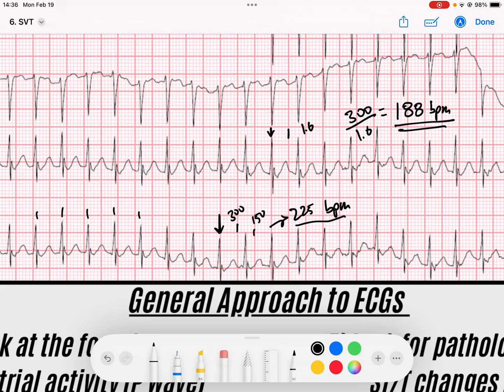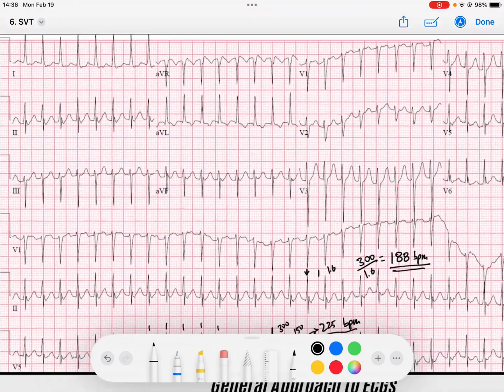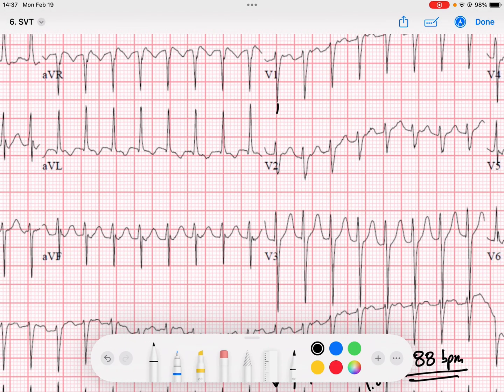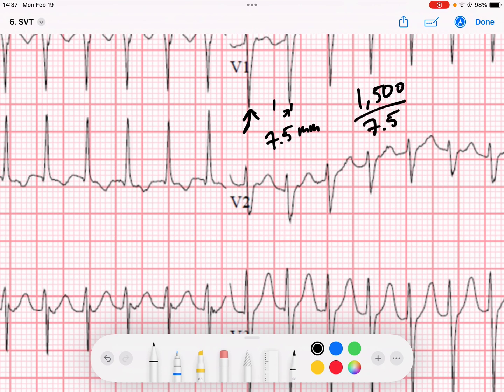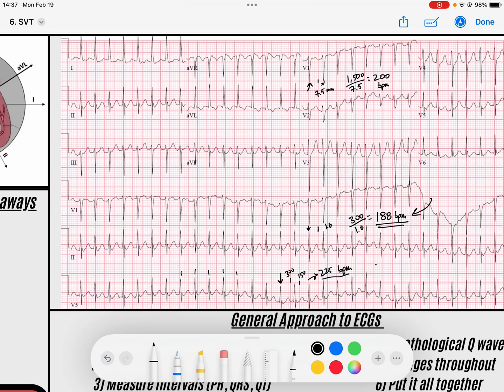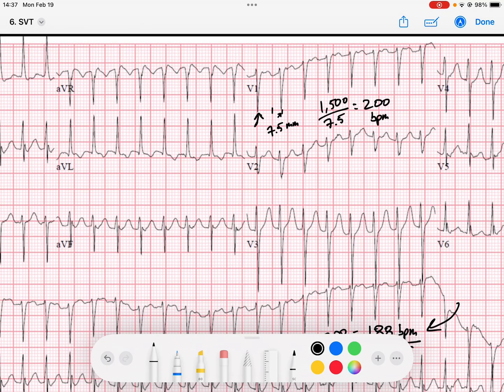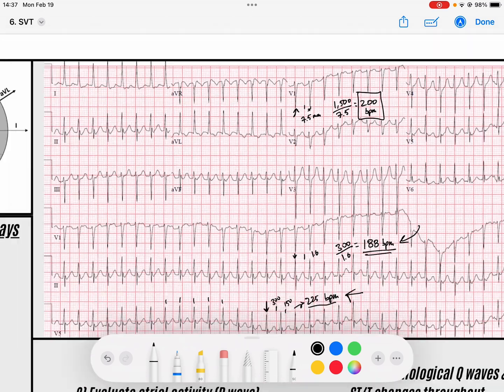Let's calculate the SVT rate using the little-box method. Finding a QRS near a solid line, I count about 7.5 little boxes to the next QRS. So 1,500 divided by 7.5 gives us 200 beats per minute. There's always going to be some error with the first two methods, so for really fast rhythms, 1,500 divided by the number of little boxes is the best method to use.